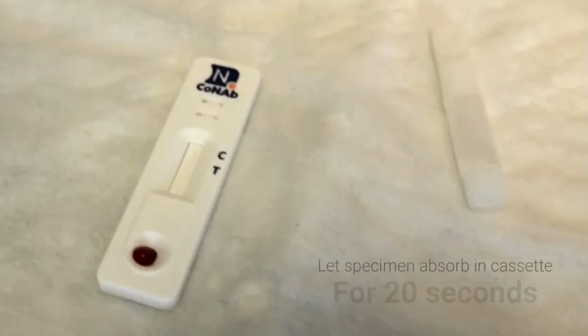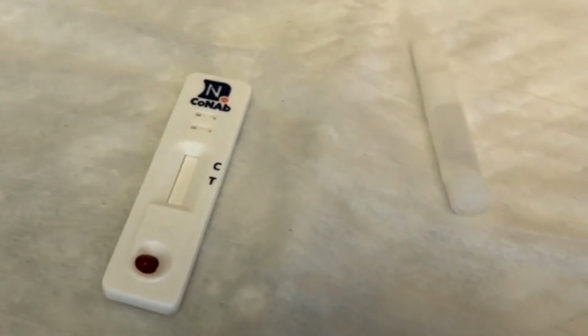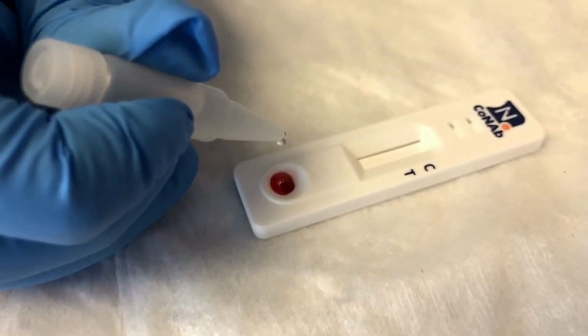Following dispense, let the specimen absorb into the pad for 20 seconds. Then use the dropper bottle to sequentially dispense either 3 or 5 drops of sample buffer, depending upon which container you have. Incubate for 15 minutes using a timer.